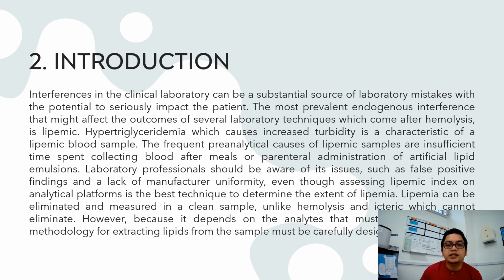Interference in clinical laboratory can be a substantial source of laboratory mistake with the potential to seriously impact the patient. The most prevalent endogenous interference that might affect the outcome of several laboratory techniques, which comes after hemolysis, is lipemia. Hypertriglyceridemia, which causes increased turbidity, is a characteristic of the lipemic blood sample.